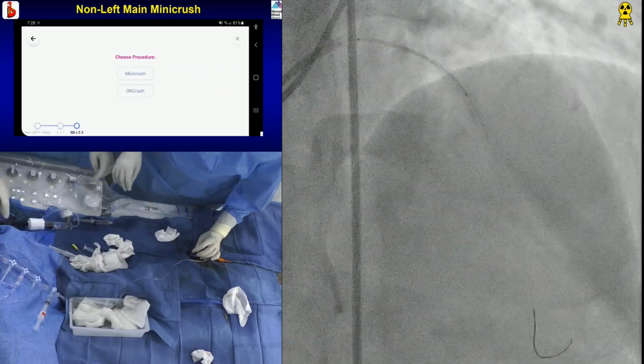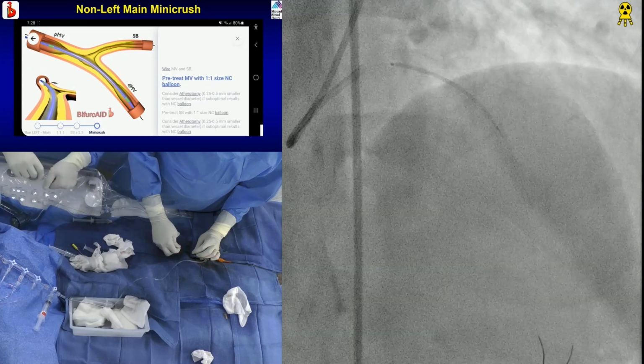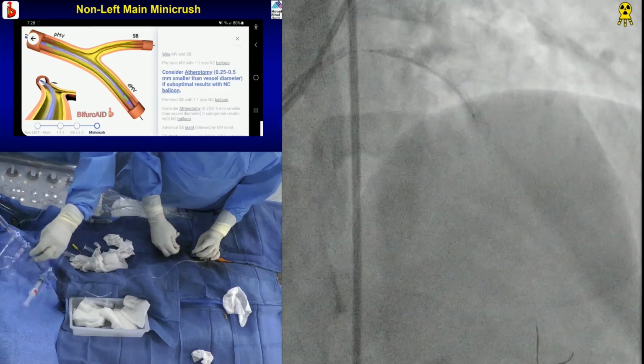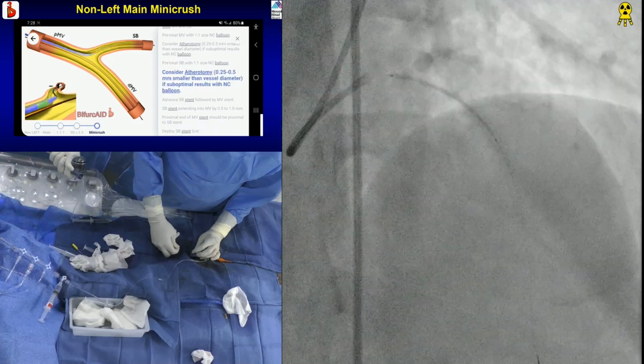Go on. Wait. Where is this? So this one. I'm going in a little bit. Okay, now the diagonal. Yeah, it's a lot of overlap, fine. Some overlap. Good, right? Very good. Go up. That position looks good. Yeah, go up.